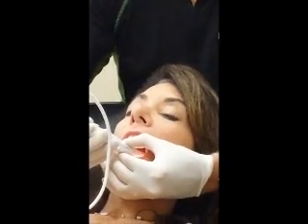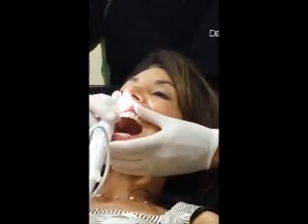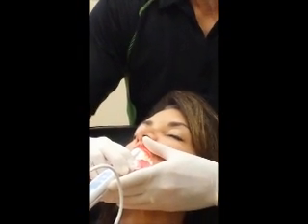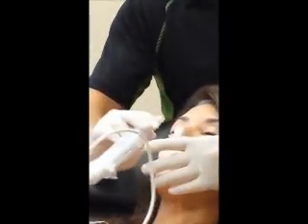The final focus point, all the way down, is really, really close — this would be your super macro. The only difference between that and macro is that you're fulcrumed and you're closer to the tooth. Look how close I am now — I'm right on top. You'll see how I'm fulcrumed right on top of that tooth. If you have fracture lines that you want to transilluminate, that's a great application — go ahead and open, we'll look at these anteriors. You can see how close you can get and actually transilluminate the enamel. If there's a fracture, it's really going to show up. See that vertical fracture there on that tooth? We're practically touching the tooth with the lens. Notice the technique so I can still freeze that image and maintain stability — I'm actually pressing against the tooth and using my index finger down below to capture.